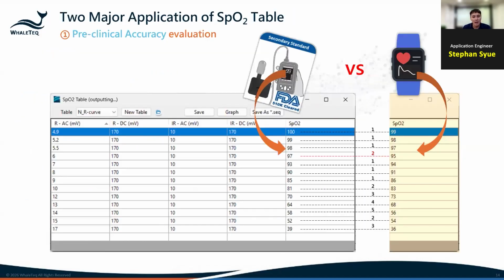Before I leave the bench test workflow, let me be explicit about the two practical uses. Number one is preclinical accuracy, where you can build preclinical engineering confidence. Before that, we will mount your device and the 510(k) devices on the simulator in turns.